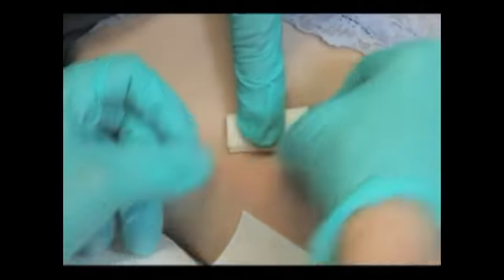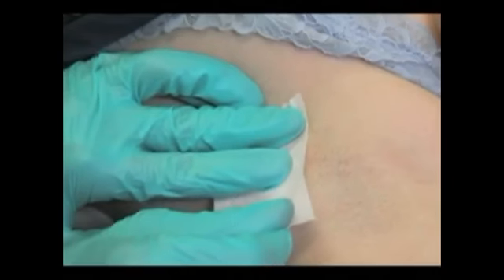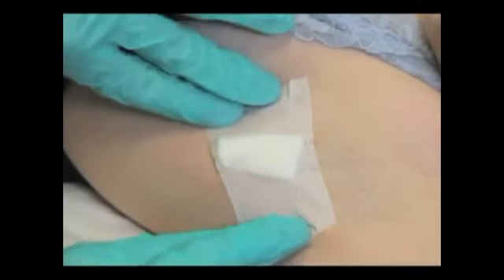In patients with thrombocytopenia or those taking an anticoagulant, it is typical to place a pressure dressing over the sutured site to prevent late-onset bleeding. It can be left on for 24 hours.